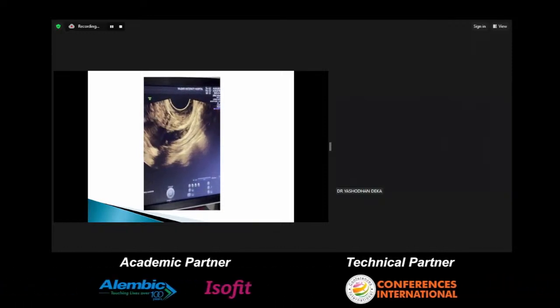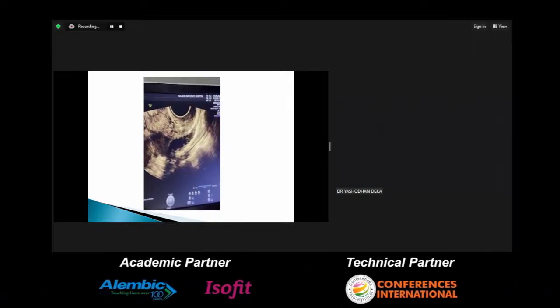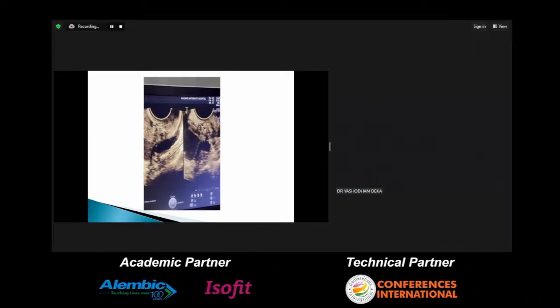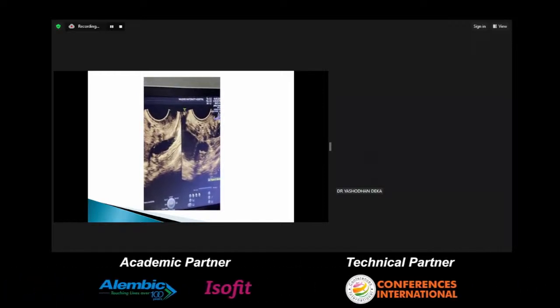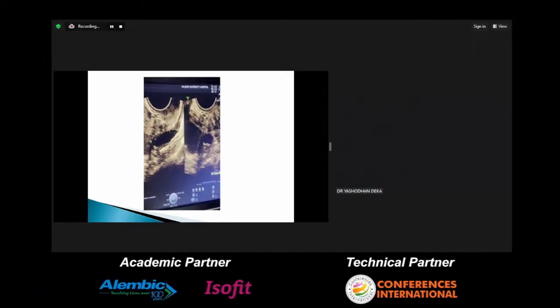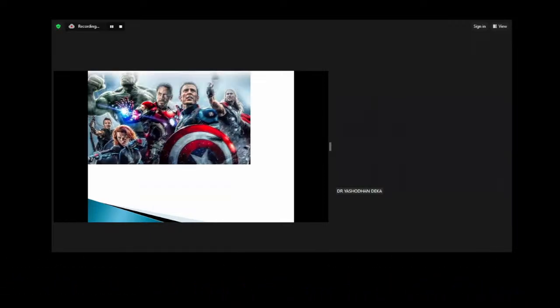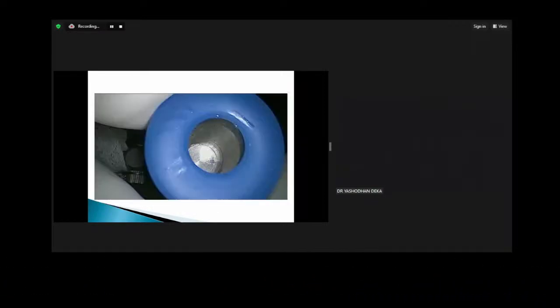So this is a scan that is done by ourselves. You can see the bowel nodule very clearly. You just slide your probe behind the cervix, go to the posterior fornix, and you can see the rectal nodule very nicely. So take it in two sections because you're supposed to measure it like how I'm showing you right now. This is the entire length of the nodule traced, and then we see the depth of it, and this is the transverse, because this really helps you to counsel the patient. So this is more than 3 centimeters, so definitely a segmental. You should have your correct team, you should have the correct weapons in your theater to deal with such situations.